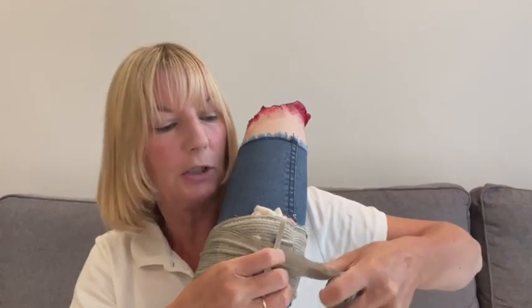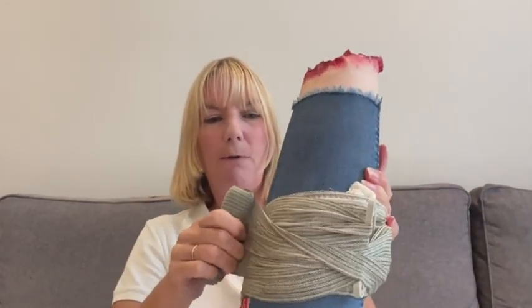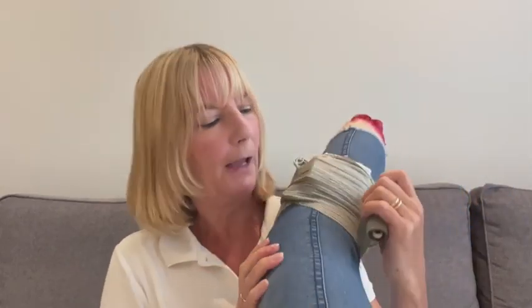So you stretch it round, and then in this particular one you put it through the bar. There's different ways of using it. You can put it through the bar and go back on itself, and that can increase the traction that you put on it. And you can also do an added twist on there every time you go over the bar, that again will increase the amount of pressure that you are putting on and across the wound. So you would just twist as you go over. You need to make sure you go above and below the pad as well, so that no stuff and debris can get in. These are all used in battle, so these are designed as battle dressings for you.